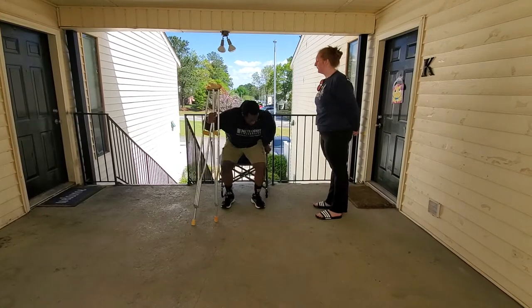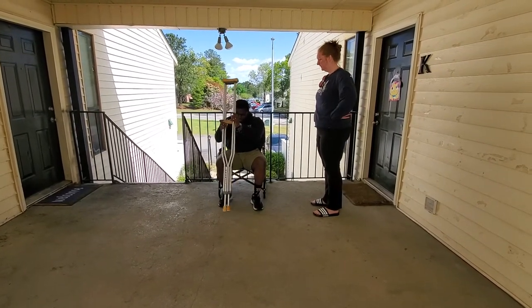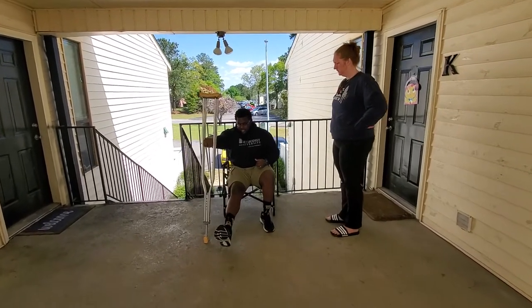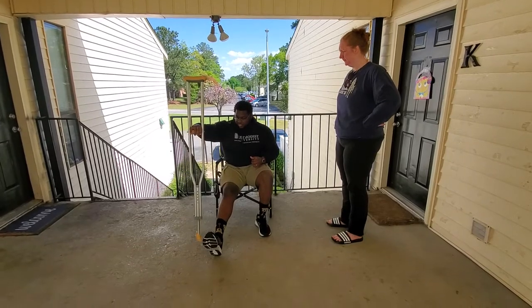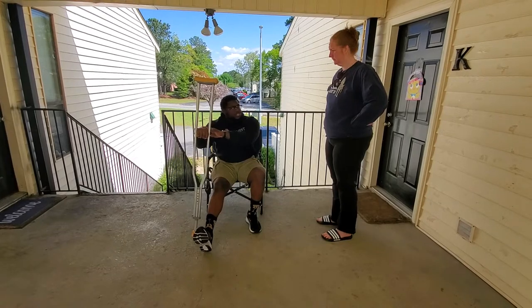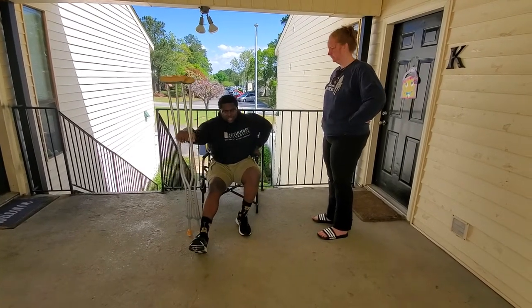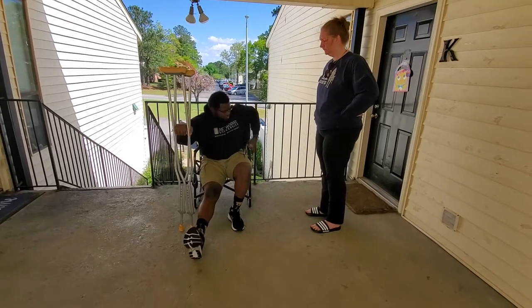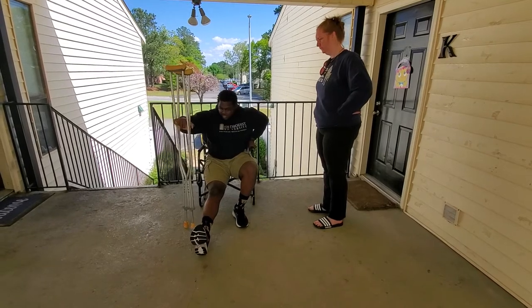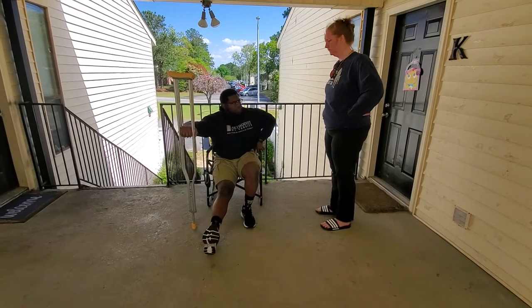I'm going to guide you through this after this demonstration. You're going to sit in the chair. You want the crutches on the side of your right leg — the side you had surgery on — and you want to drive your weight through the crutches on that same side. Slide to the edge of the chair as much as is comfortable, drive your arm on the opposite side through the chair, stand up, and keep as little weight as you can on that leg.